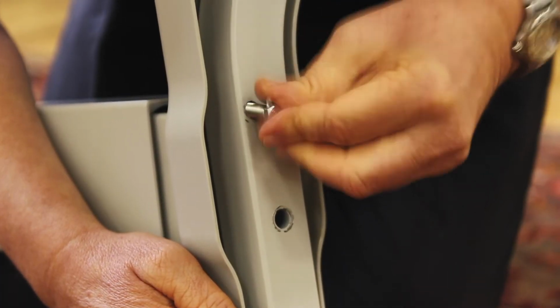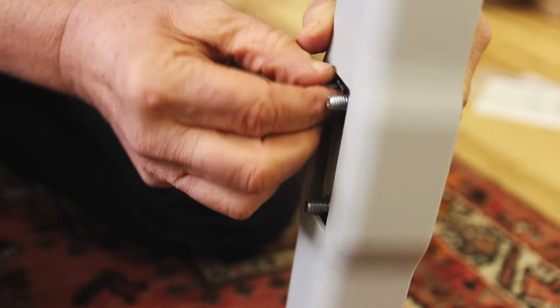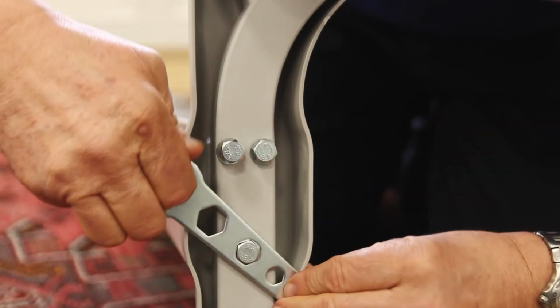Make sure you have the washers in place with the spring washers on the side closest to the post. Twist the large screws until the post is fixed to the base. Then tighten using a spanner.